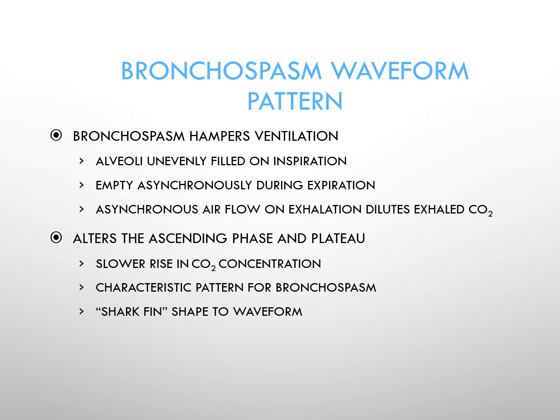And again, to remind you guys, I referred earlier to the shark fin shape that may accompany a severe bronchospasm if a patient also has end-tidal CO2 in place while they're having the bronchospasm. So think about what happens. The alveoli unevenly fill on inspiration. They also empty asynchronously, or unevenly, during expiration.